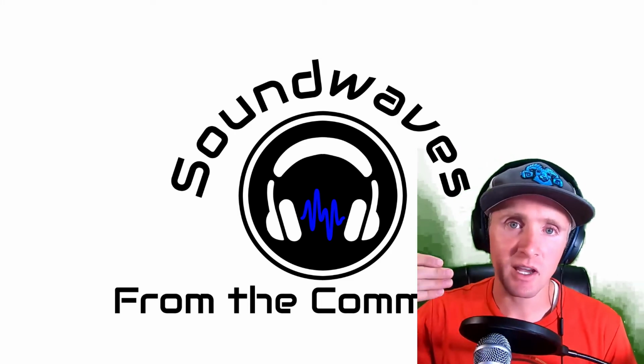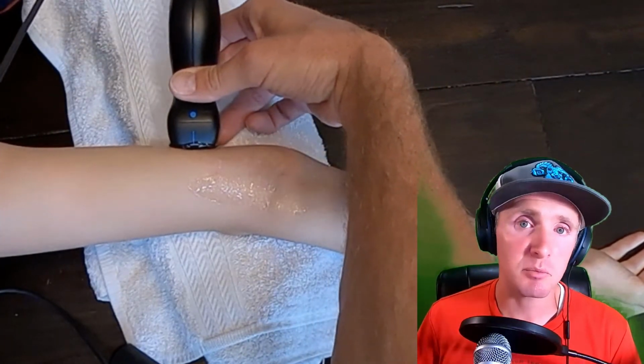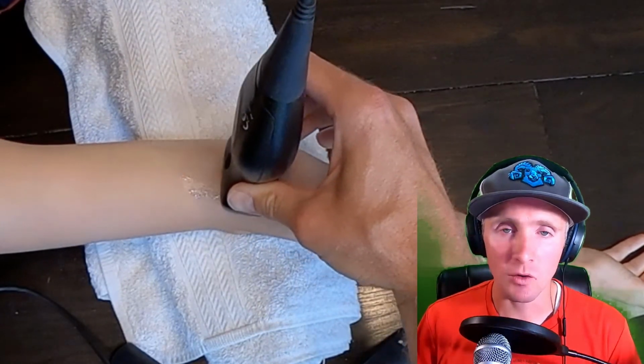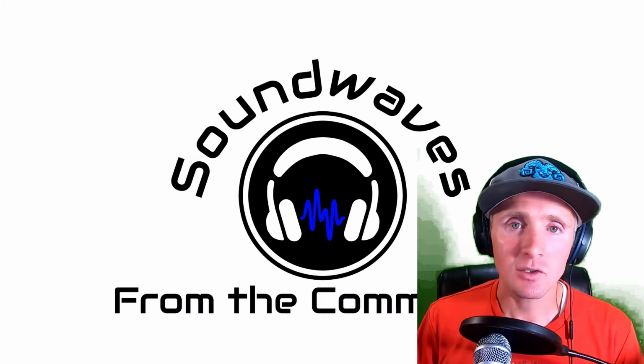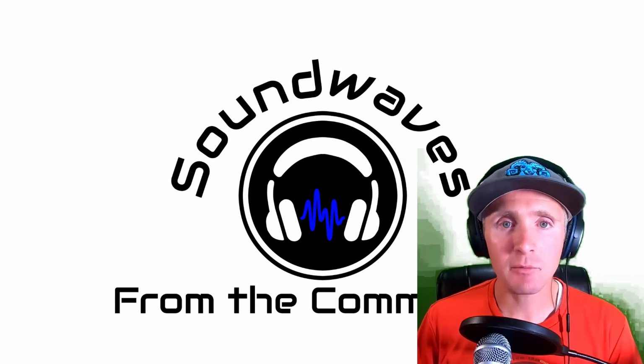So again, slide side to side. I would sweep up and down the arm as well to see if it dives, if it splits, if it gets bigger. You want to know which direction this vein is going, so once you start your attempt, you know which angle to direct your needle so that you can get the needle tip into that vein. And so that's going to be your acquisition.